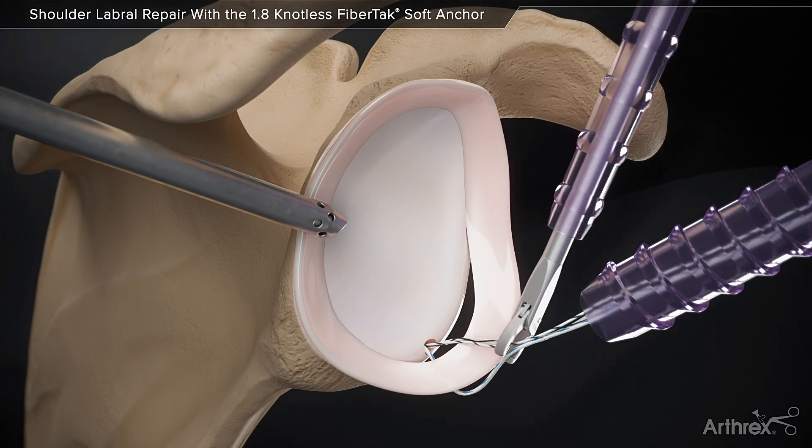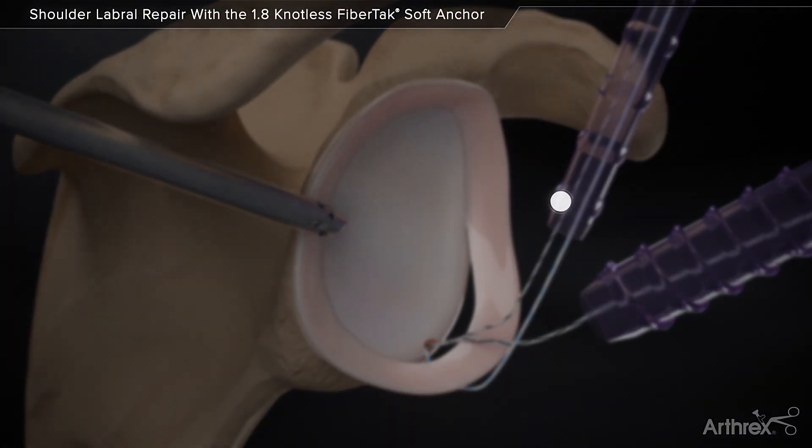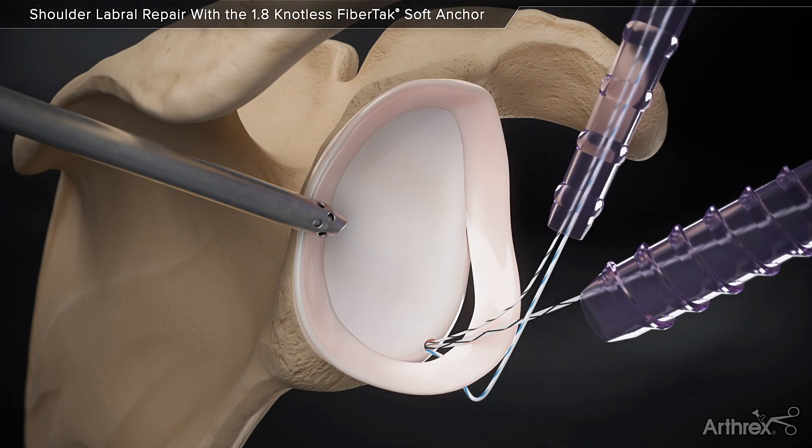Retrieve the repair suture and the looped end of the 2.0 Shuttling Suture. Load the repair suture through the suture loop. Fold the repair suture limb at the indicator mark on the suture.